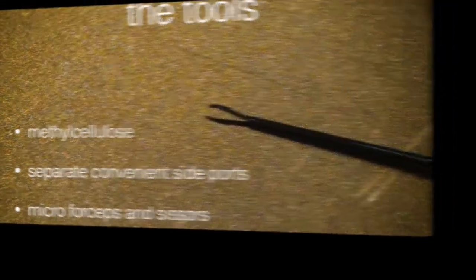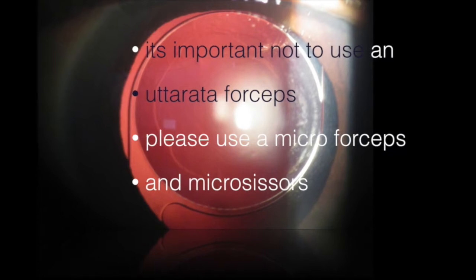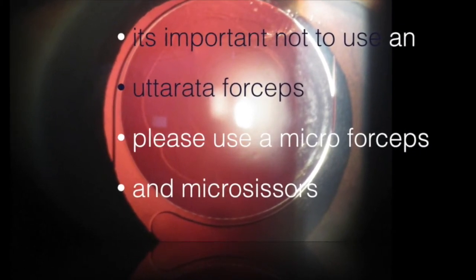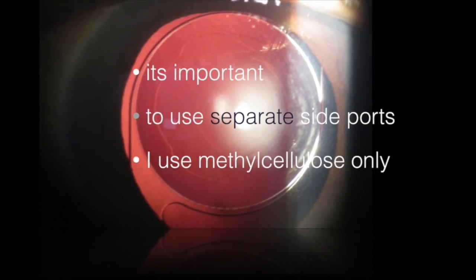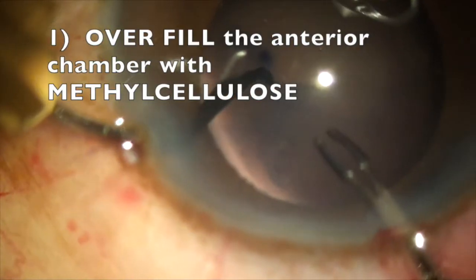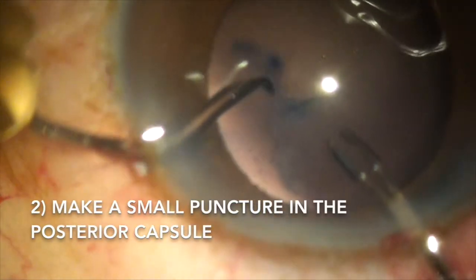We have to make a separate entry away from the main incision. It is important not to use an Utrata forceps, and we have to remember to lift up the posterior capsule when actually doing the capsulorhexis. I only use methylcellulose; I do not use a cohesive viscoelastic. The first step is to overfill the anterior chamber with methylcellulose.